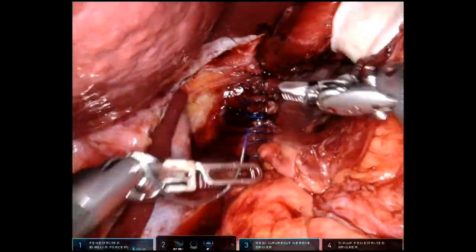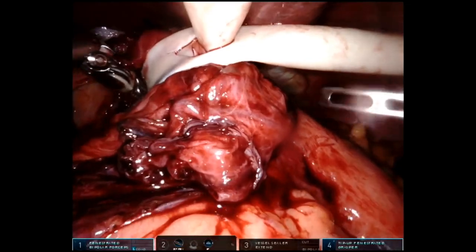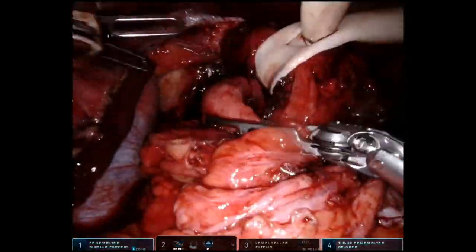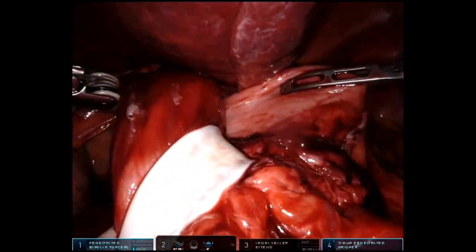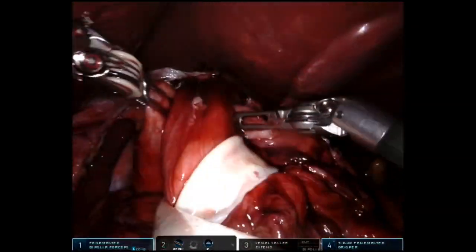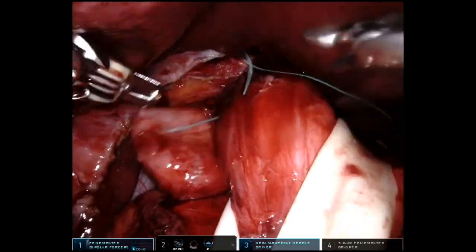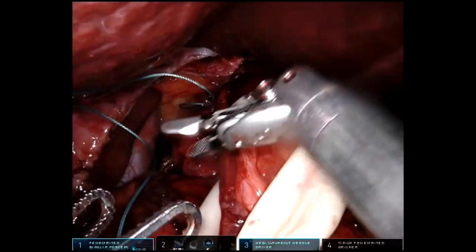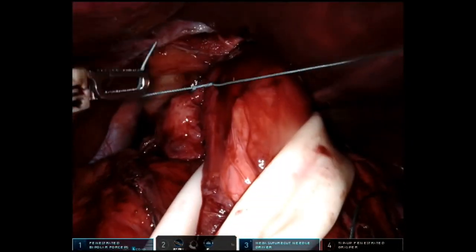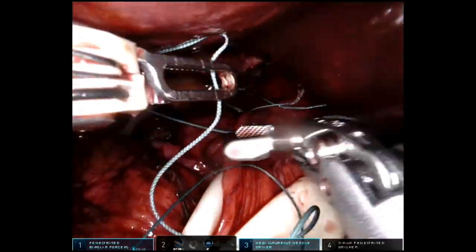Once those muscles are closed and the diaphragm is tightened around the esophagus, the last step is to do a fundoplication, wrapping the stomach around the esophagus-stomach junction. My personal preference is to do a partial — called a Toupet posterior 270-degree fundoplication — in this situation, though lots of surgeons do a full Nissen 360-degree fundoplication. That's a surgeon preference based on patient factors, particularly whether they have preoperative esophageal dysmotility issues. It's always a give and take of how much dysphagia you're willing to risk versus how much acid reflux you're willing to risk long-term. This fundoplication is done with three separate sutures on each side, usually spaced one centimeter apart.